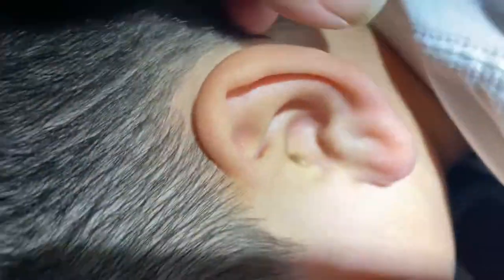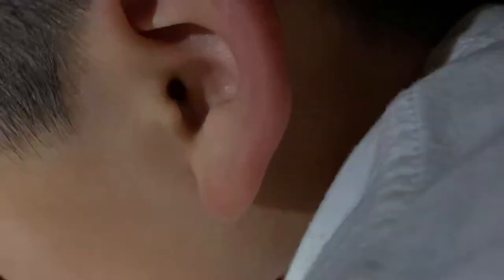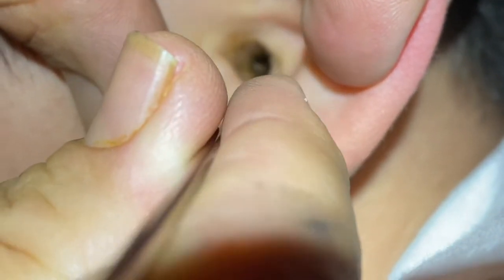We're gonna start scooping out some earwax from around these areas. It's gross — gross enough looking. Camera kid, keep recording. Grossness is gonna start right now, don't move too much kid. Look at this — look at that big earwax plug. Grossness, grossness.